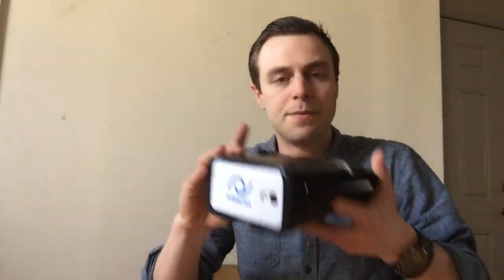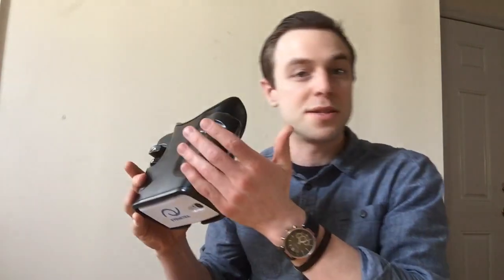To wrap up today, I'm going to run myself through an iNetra refraction so you can witness firsthand how the autorefractor operates. I open up the Netra application and load the phone right into the autorefractor, ensuring iNetra is face up. The device speaks to you along the way.